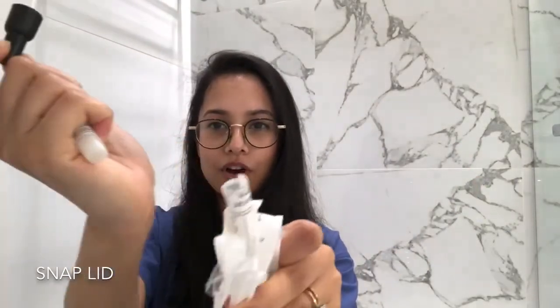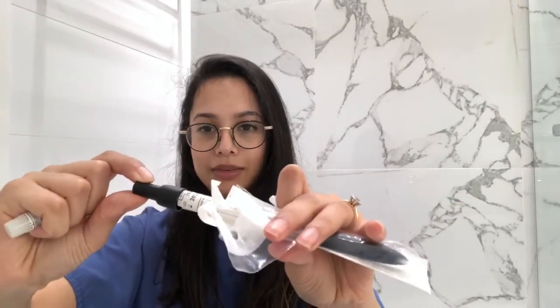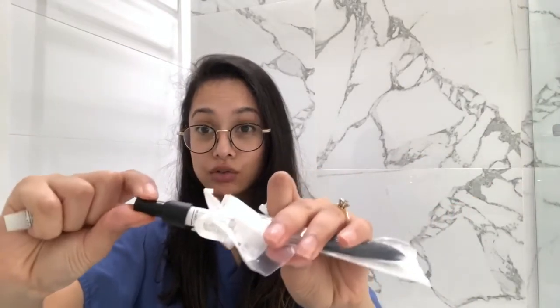The next bit is the most crucial part. You want to take this tube, snap off the lid, and then put this directly in. Make sure that the lid is secure, and now you have it — your completed swab.